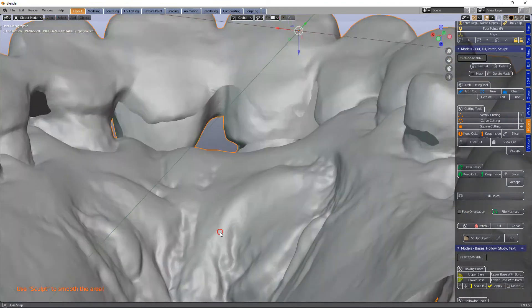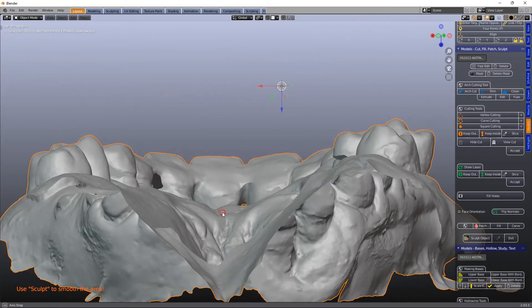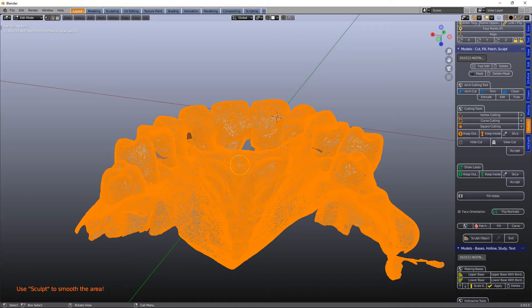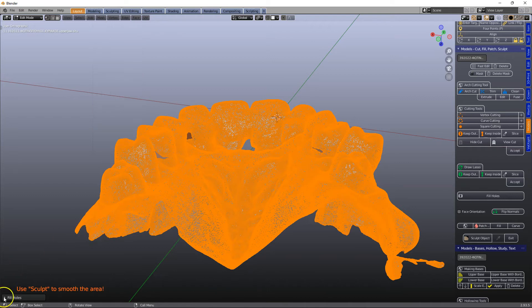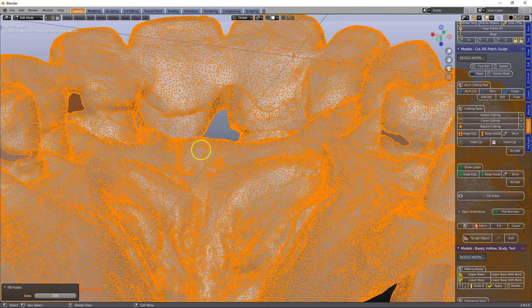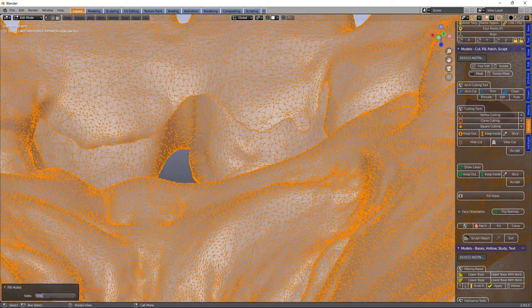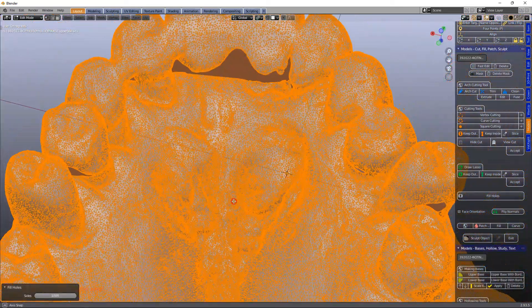So what we're going to do is — the algorithm won't fill it, but maybe we can fill it in another way. Tab A, Mesh, Clean Up, Fill Holes, and here just open up this menu on this side and put like 500 maybe. No, this still hasn't filled — let's put it 1000. Yep, so that's filled it.